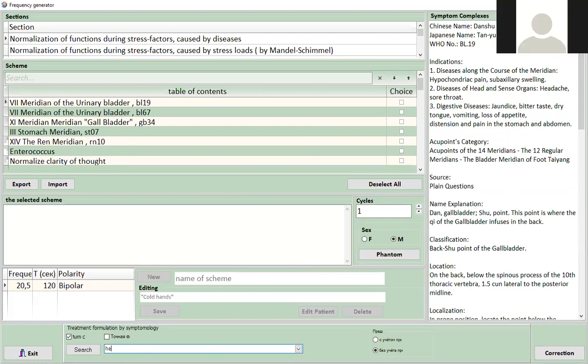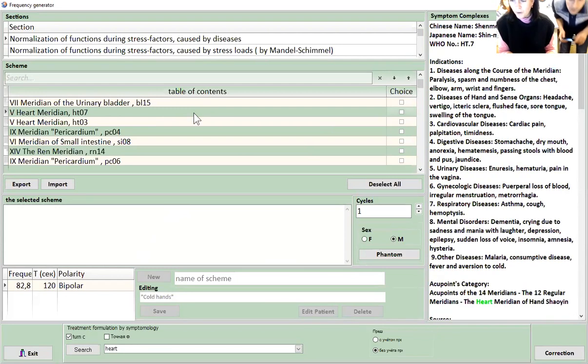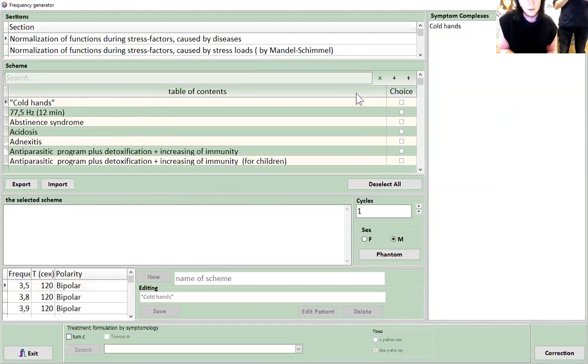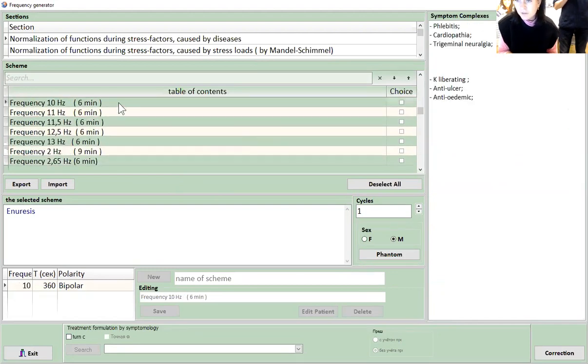Why didn't you choose those two that had to do with the heart meridian? I just wanted to see a little bit more. The heart points, like heart meridian, you can also read about cardiac pain, but less about blood. So basically, you can choose a lot of stuff, but I want just the easy one to normalize. Then I go through this one better. I'll turn off. I'll go to this normalize. Where is normalize here? Somewhere in these frequencies. Cardiopathy. No, it's not this one.